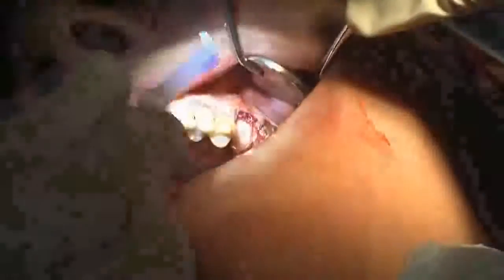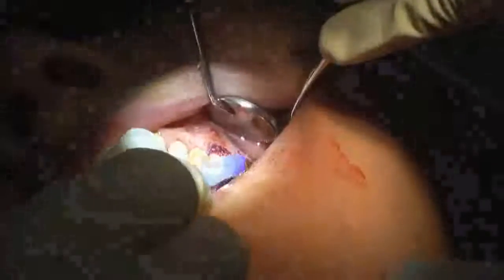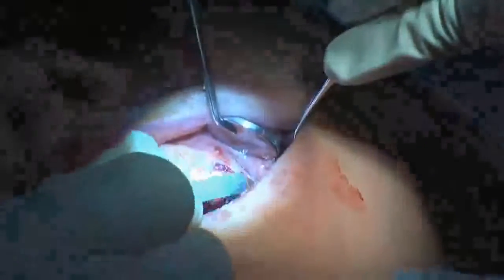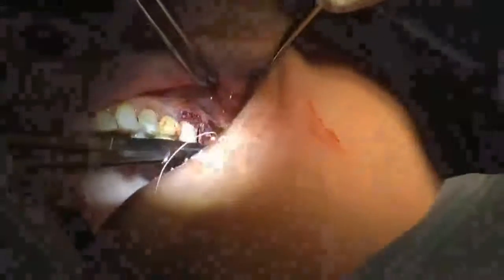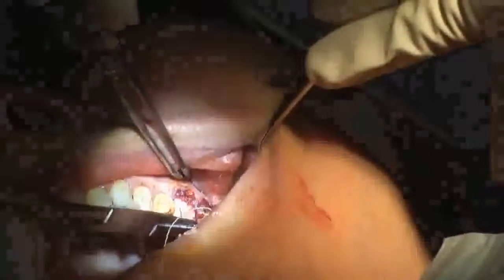I apply it to the gingival margin, going around the periphery one quick time, and that stops any bleeding. You don't want to get the tip of the pipette into the blood, because then it will begin to set and you'll get stringy Periacryl that you have to trim off. So I'll go in one time and then wait a few seconds to make sure it's fully set.